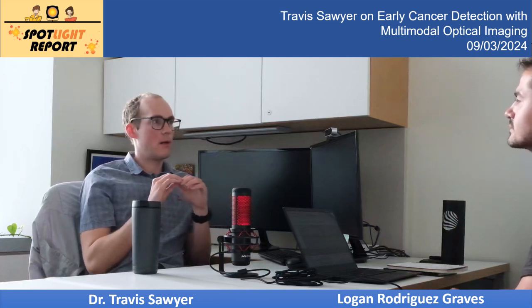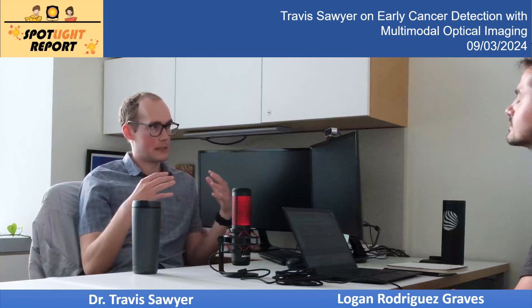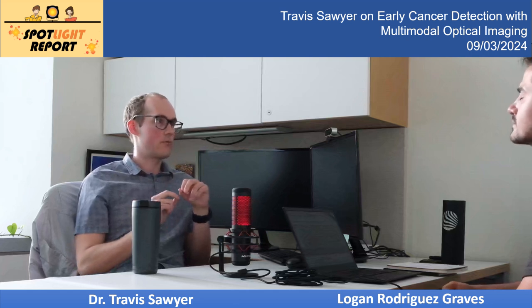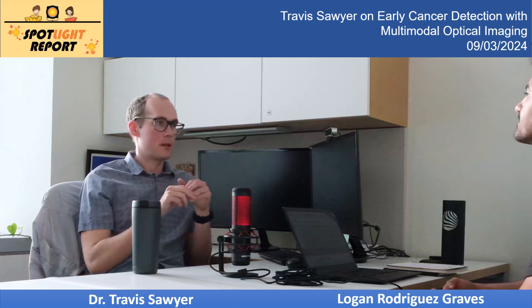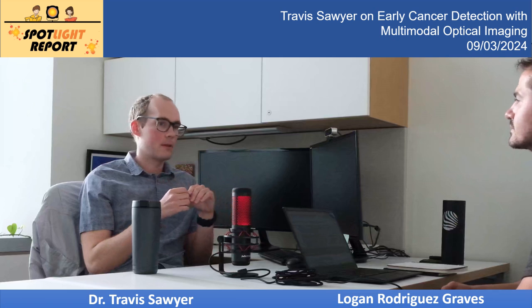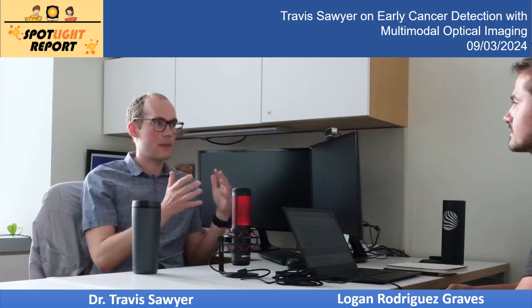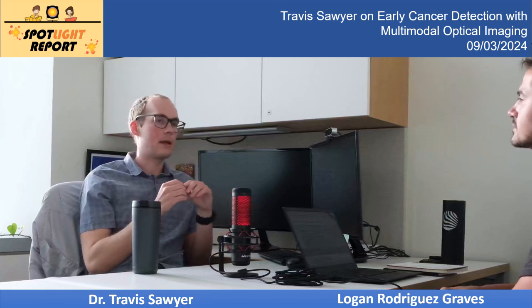Feature extraction, again, this is a pretty general image analysis topic, but the idea there is you just want to come up with quantitative descriptors of things that you see in the image. It could be anywhere from, like, if you have a network of lines like collagen, things like how straight they are, how dense they are, that type of thing.